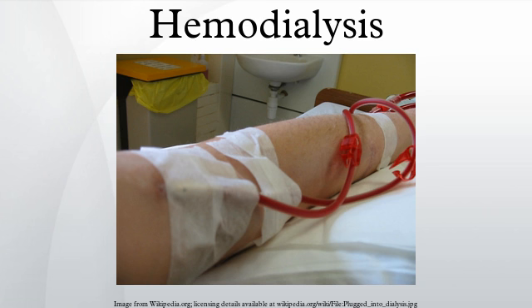In such patients, alternative anticoagulants can be used. In patients at high risk of bleeding, dialysis can be done without anticoagulation. First-use syndrome is a rare but severe anaphylactic reaction to the artificial kidney. Its symptoms include sneezing, wheezing, shortness of breath, back pain, chest pain, or sudden death. It can be caused by residual sterilant in the artificial kidney or the material of the membrane itself.